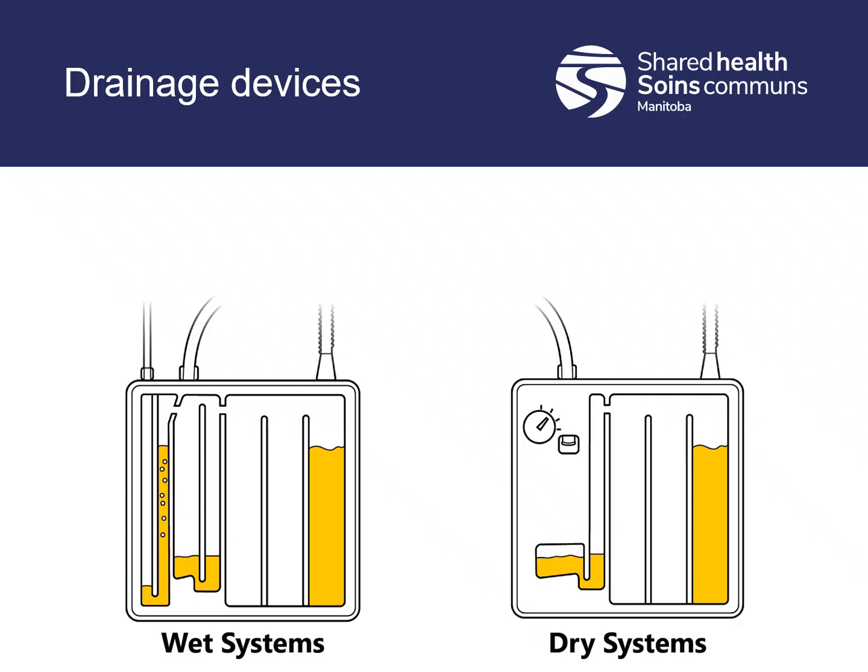So we have wet and dry systems here. The most important difference between wet and dry chest tube suction lies in the mechanisms creating negative pressure. Wet suction uses a column of water to regulate negative pressure, while dry suction uses a mechanical regulator. Again, they work basically the same, just different things drive that negative pressure creation to help drain the fluid or air out of the chest.